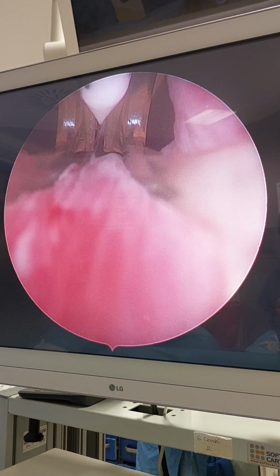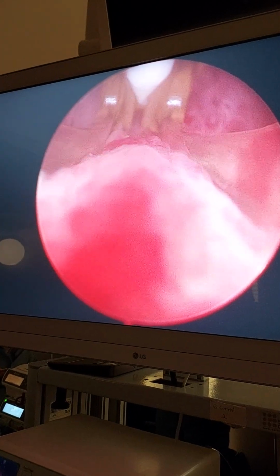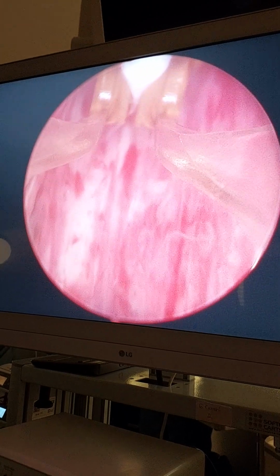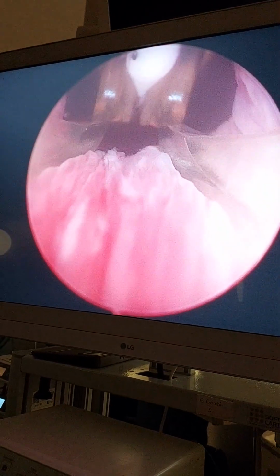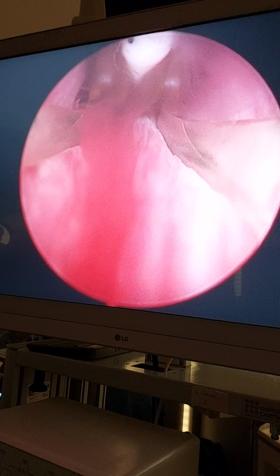So this is verumontanum, where the inflammation was coming out, and this bleeding will stop soon. Here is the bladder neck. It's not a very long distance. This is half a centimeter here, 1 centimeter, and 1.5. Yeah, less than 2 centimeters, 1.5 to 2. This is because of the massage. Okay, so theoretically it's enough to make one steam to each side and one steam to the middle lobe.